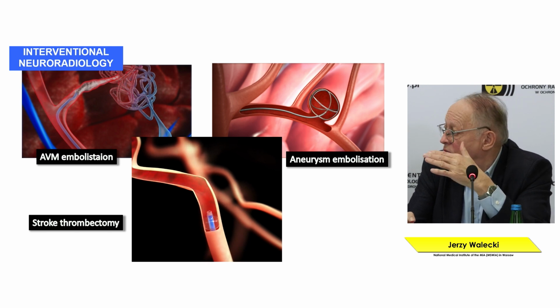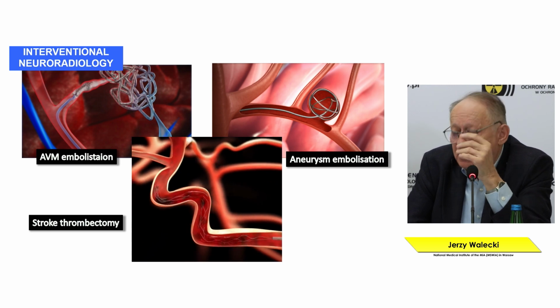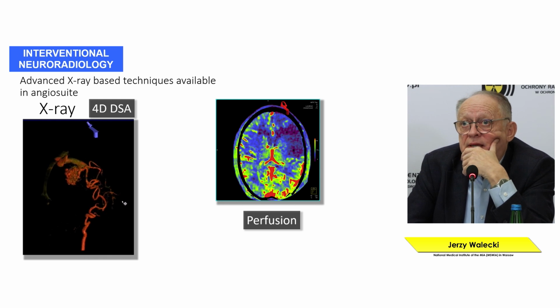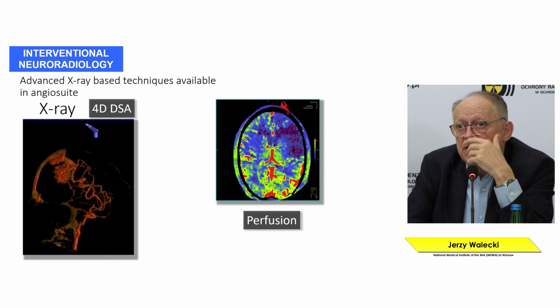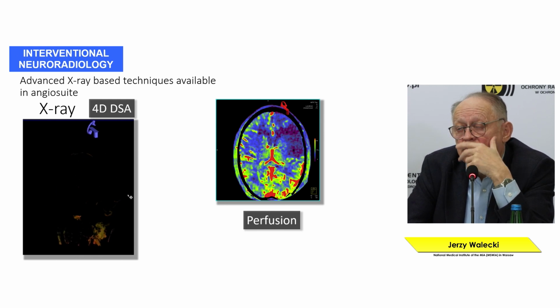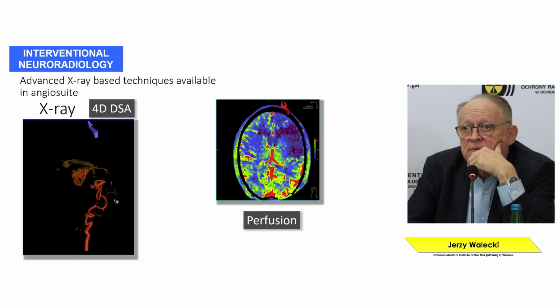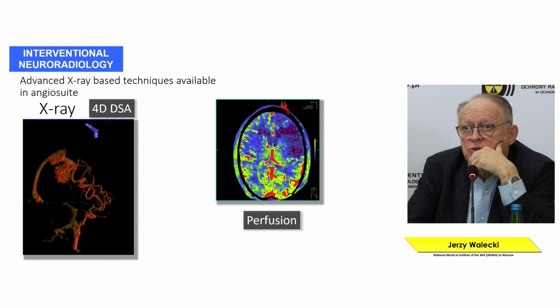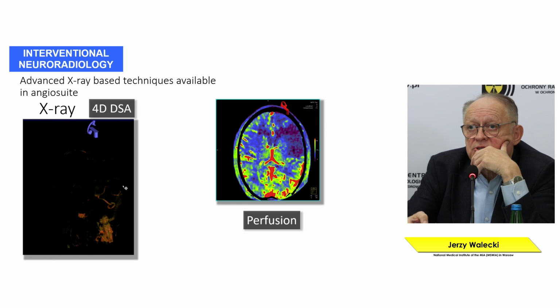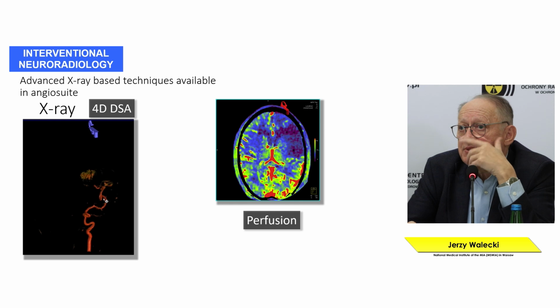where we remove the clot from the vein. These are the procedures that we are performing every day. It's also important that thanks to this modern multi-planar equipment for DSA and angiography, you can see the image where we can decide what technique will be applied where.